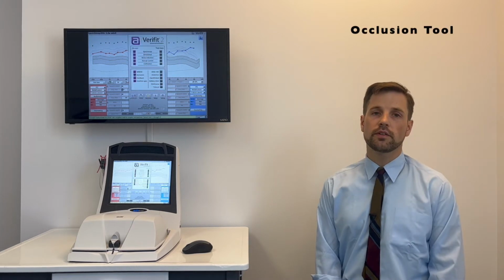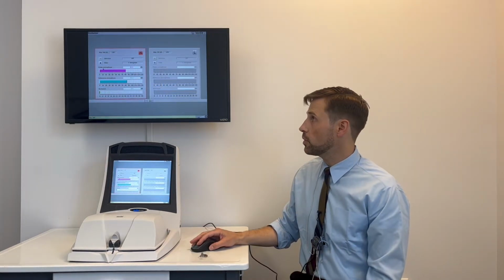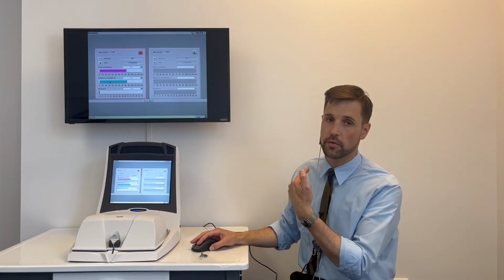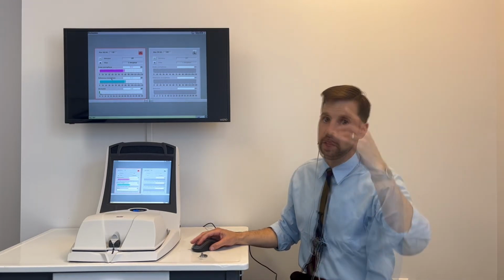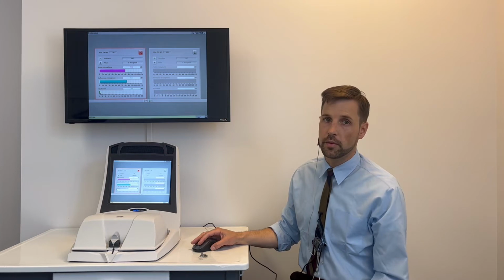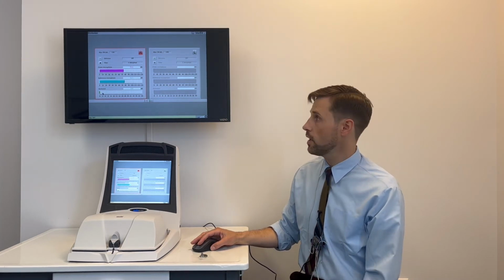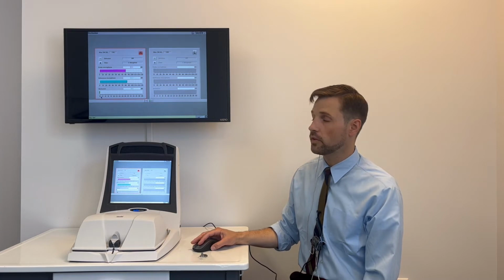When you get someone who's complaining about their own voice and you really want to figure out, okay, is this truly an occlusion problem, or are they just adjusting to the sound of their own voice through amplification? Just look at the difference between the probe microphone that's measuring at my eardrum and the reference microphone that's measuring outside of the ear canal. Now, I've got a probe tube in the ear, but nothing else, so obviously this is an open fitting, and you can see that the difference between those is essentially nil.